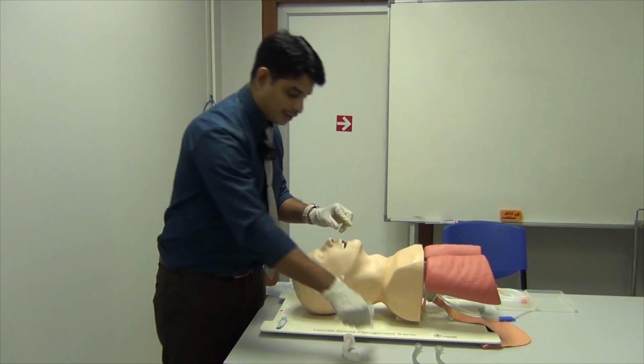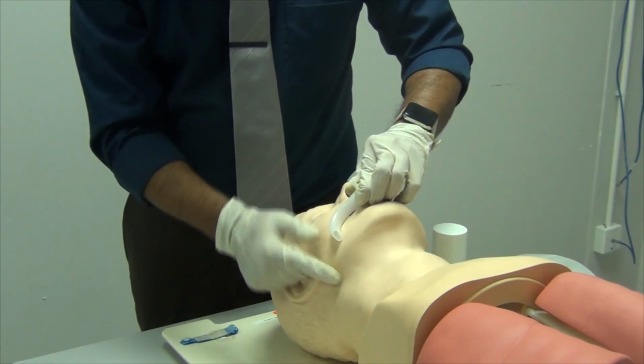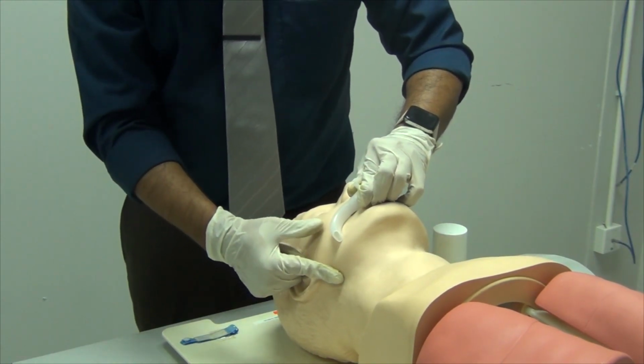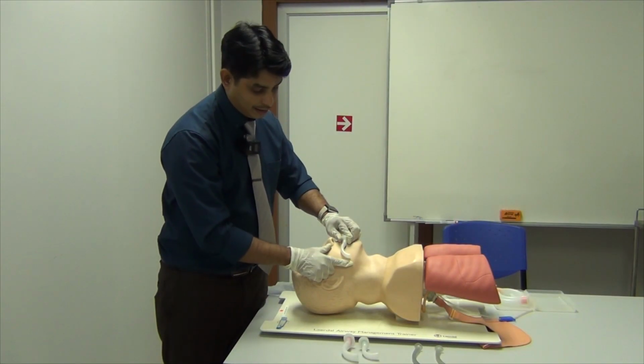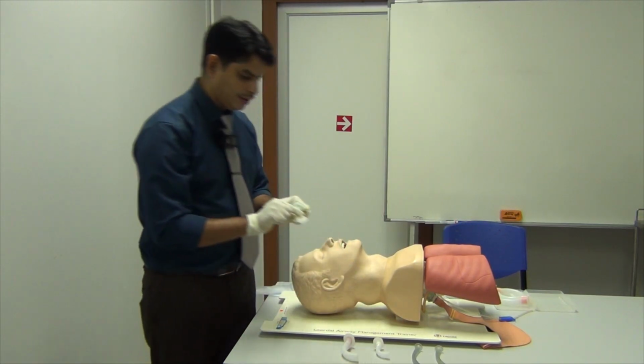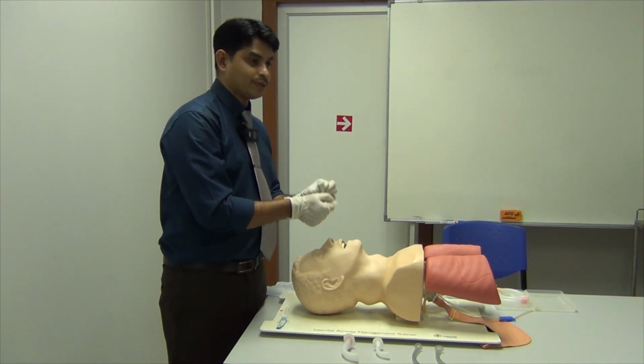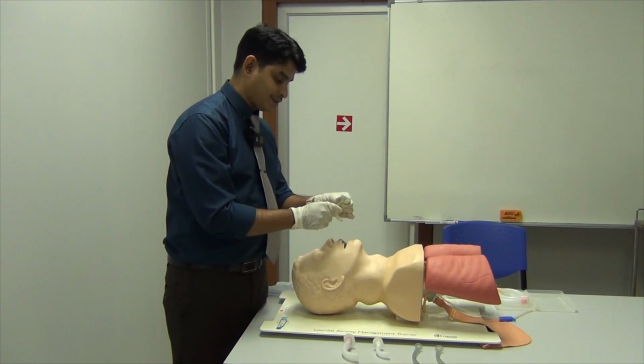So what about the other sizes? If you take this one, this is ending much before the angle. So this is not the ideal size. Always choose the correct size so that it serves the purpose. It removes the obstruction. So the next step is introduction of this OPA.